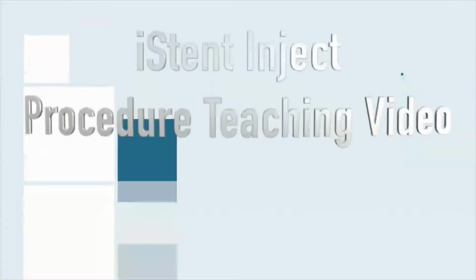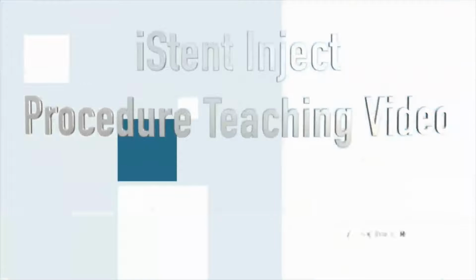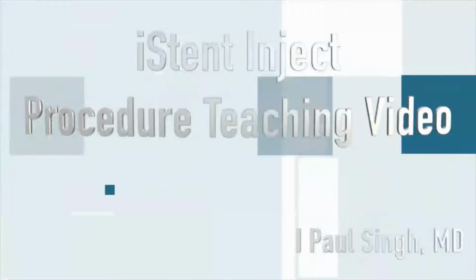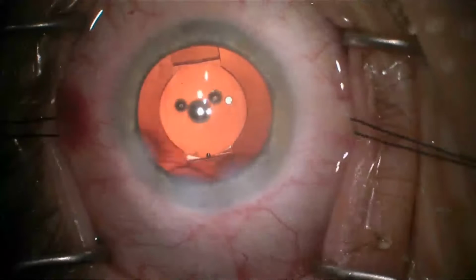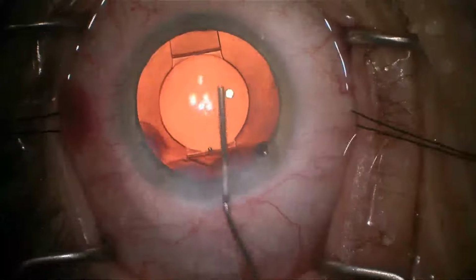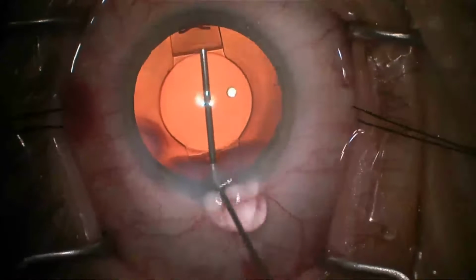Hi, this is Dr. Paul Singh describing an iStent inject procedure teaching video, focusing primarily on the importance of proper visualization during the entire procedure. Here we are after implanting the IOL, hydrating the paracentesis, and then injecting a cohesive viscoelastic to give ourselves enough space to operate and to view with the gonio prism.